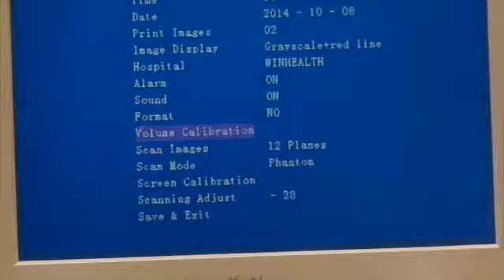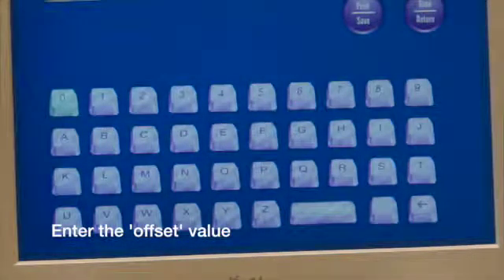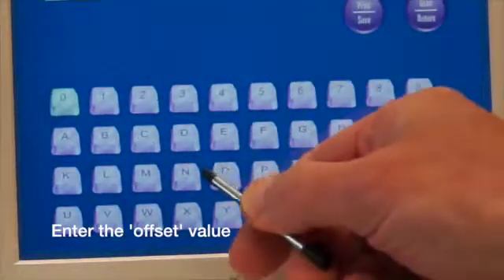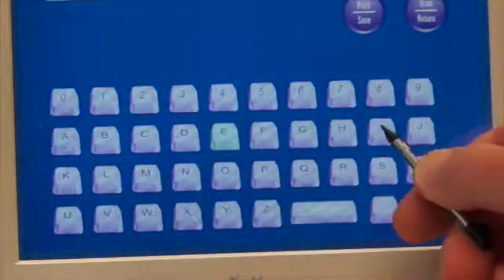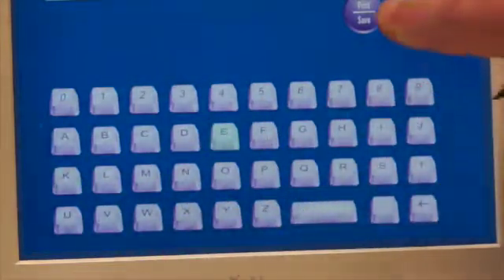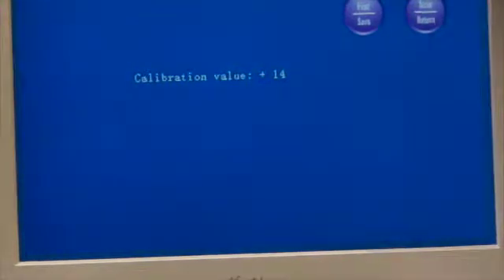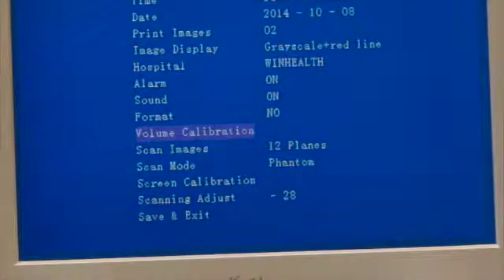You will need to go back into the menu screen and volume calibration, enter the code, which is M-E-I-K-E, and this will then allow you to put in a calibration value. Once the value is entered, you simply save and exit, and that's the calibration procedure finished.